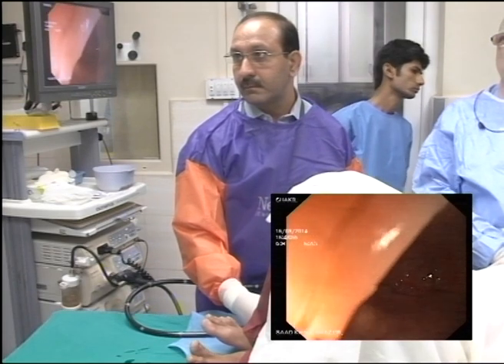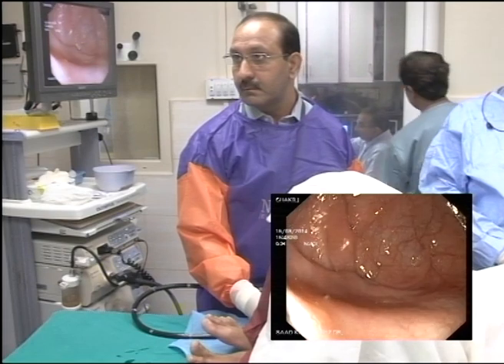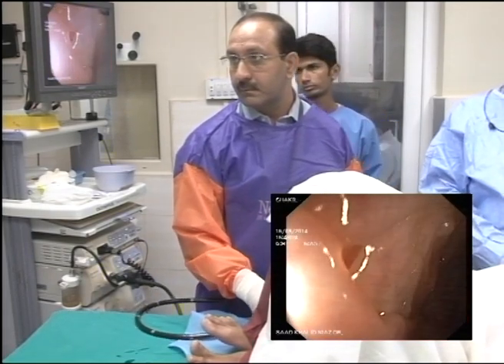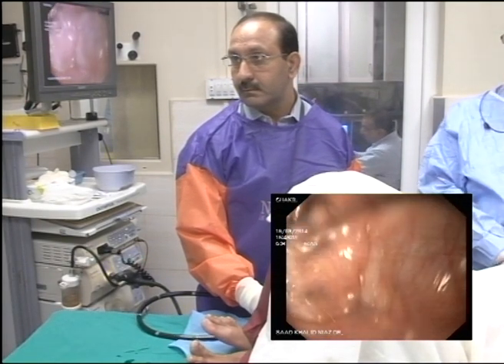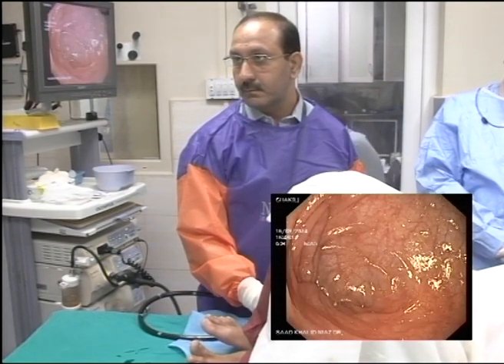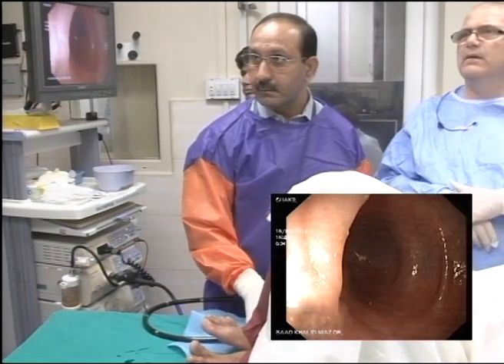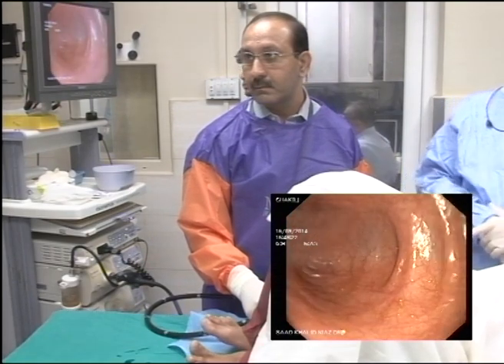this is a chap who had a very tight sigmoid with a little bit of spasm. Still continues. Yeah, it continues to be a little bit. But it's going forward nicely now. Close. Got him to slow down a little bit. So things are progressing. I think glucagon is something that we can use as well. Yeah, the only thing is that it costs more than the cost of colonoscopy here almost.